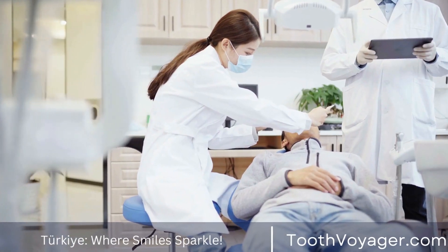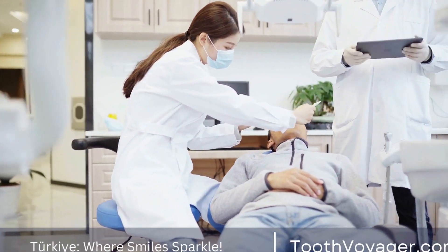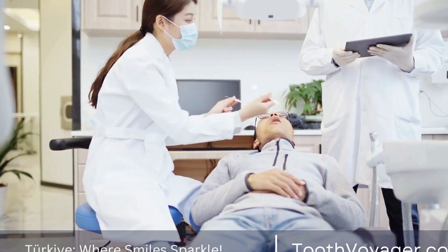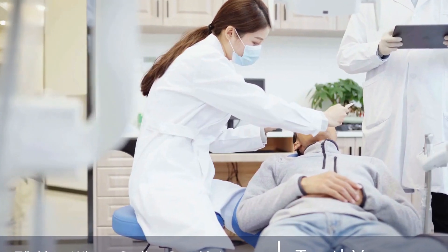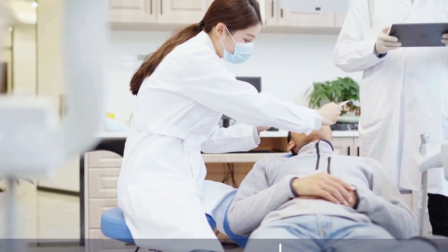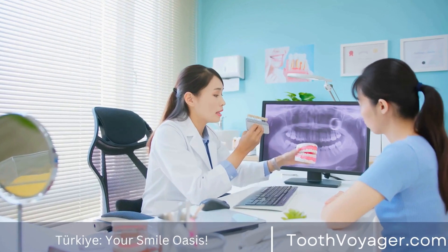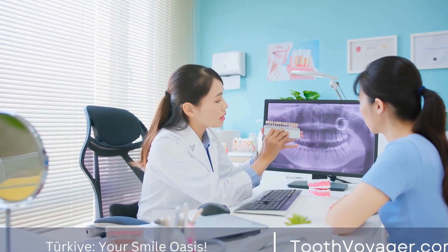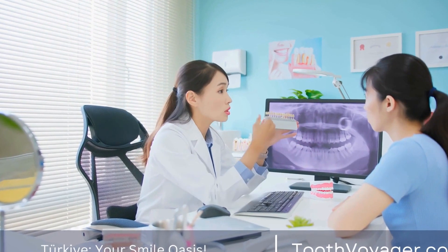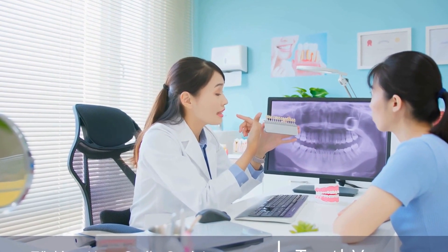Next, the mold will be sent to a dental laboratory, where skilled technicians will craft the veneers to the patient's specifications. The technicians will use the impressions to create a precise model of the patient's teeth, ensuring that the veneers fit perfectly.